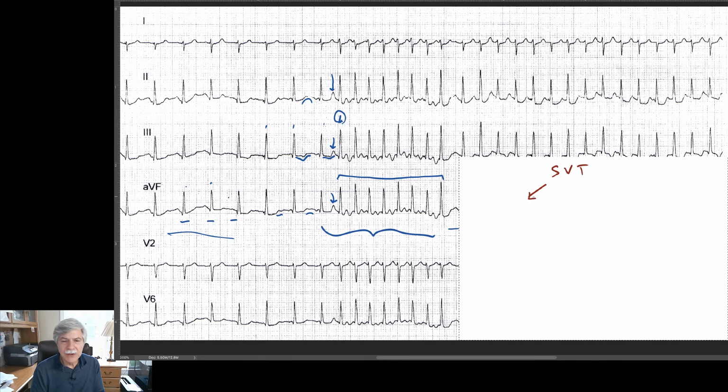There are supraventricular arrhythmias, including atrial flutter and fibrillation, that don't really fit neatly, although they're both coming from above the ventricles, right? Atrial fib and atrial flutter are coming from the atria. They're coming from above the ventricles. So in theory, these two arrhythmias are sort of a supraventricular tachyarrhythmia, but those are clearly easy to recognize. The atrial rate is 220 or plus beats per minute, usually 250 to 300.